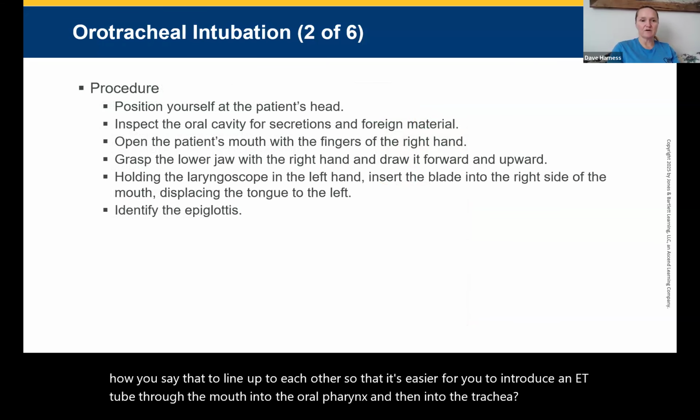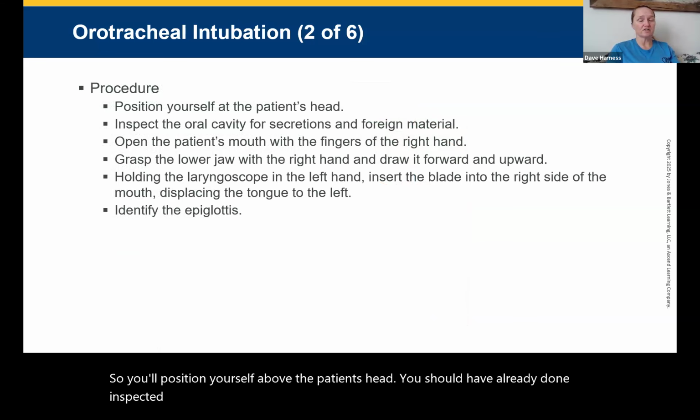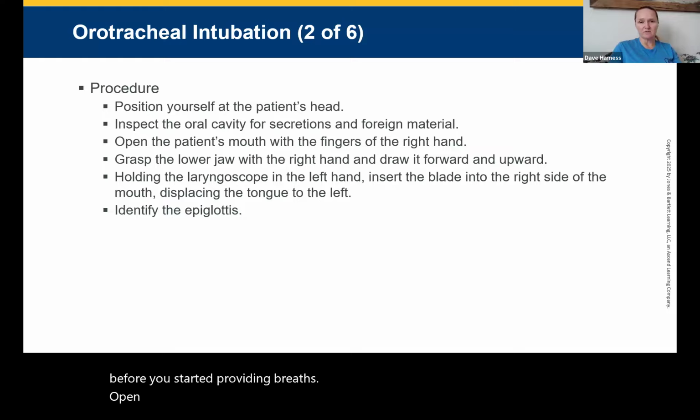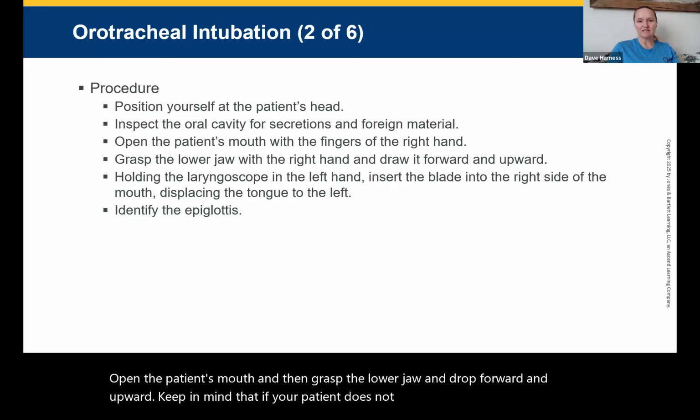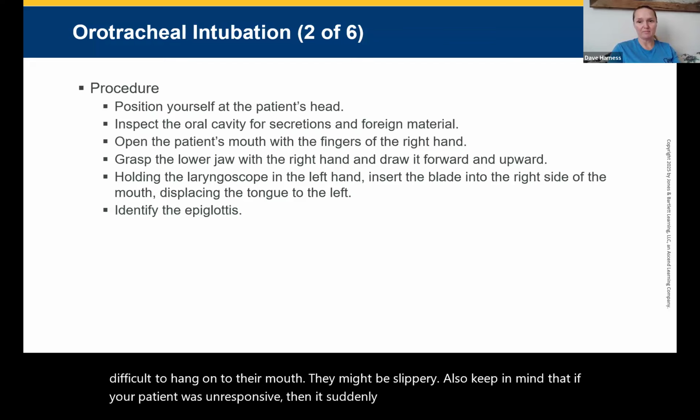So you'll position yourself above the patient's head. You should have already inspected the oral cavity for secretions and suctioned or removed them before you started providing breaths. Open the patient's mouth and then grasp the lower jaw and lift forward and upward. Keep in mind that if your patient does not have teeth, this might be very difficult to hang on to their mouth. They might be slippery. Also keep in mind that if your patient was unresponsive and suddenly becomes responsive, your hand is in their mouth and they might bite you.